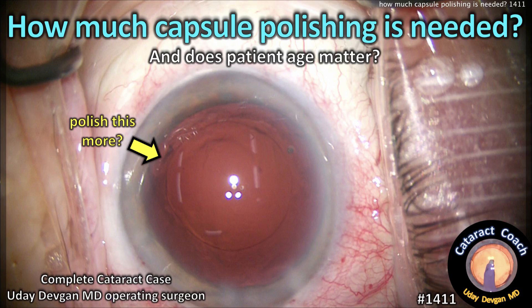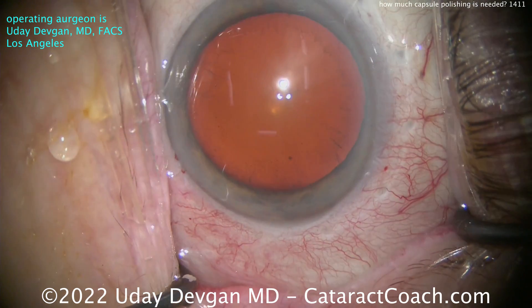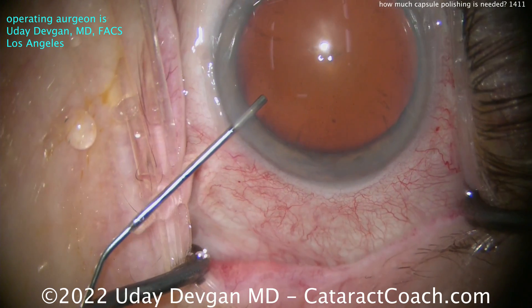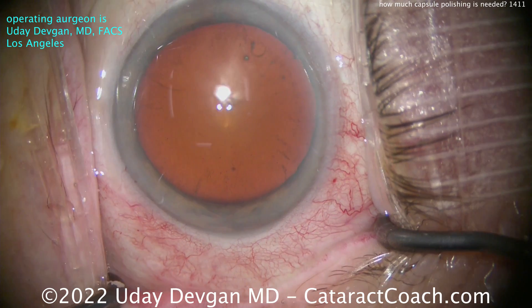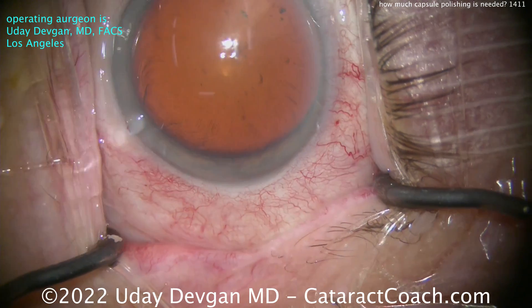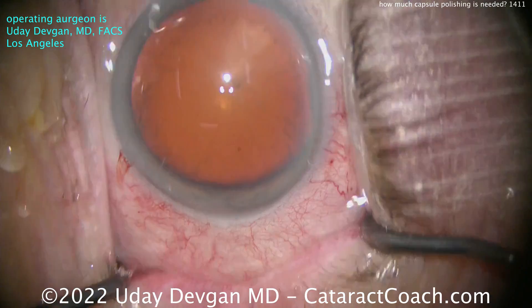CataractCoach.com: how much capsule polishing is needed, and does patient age matter? I'm going to show you a complete cataract case start to finish. Here's the patient — look carefully at the anterior lens capsule. The patient has pseudoexfoliation syndrome. The dilation is pretty good and the zonular support is reasonable, but look at all that anterior capsule material — pseudoexfoliation material on the anterior lens capsule. You can see that distribution of it. Filling the eye with viscoelastic now, let's get that main incision done.